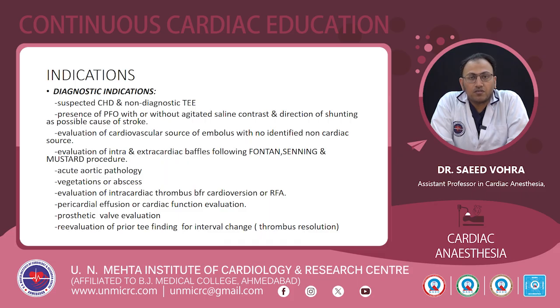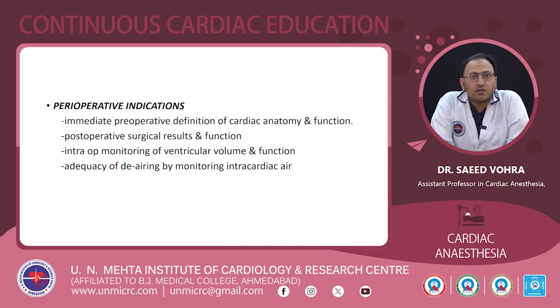vegetations in the valves. Among the perioperative indications, TE is used for immediate preoperative definition of cardiac anatomy and function, for postoperative surgical results and function, for intra-op monitoring of ventricular volume and function, and for adequacy of de-airing by monitoring intracardiac air.